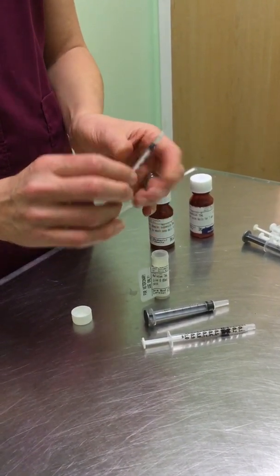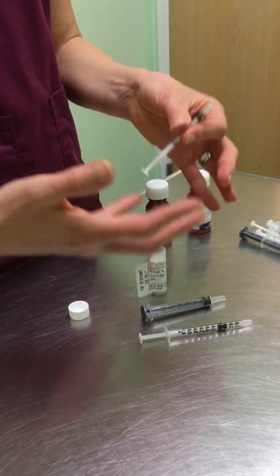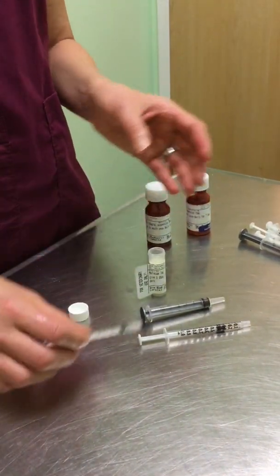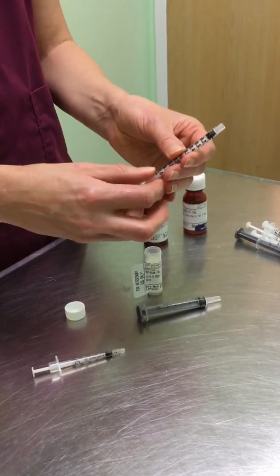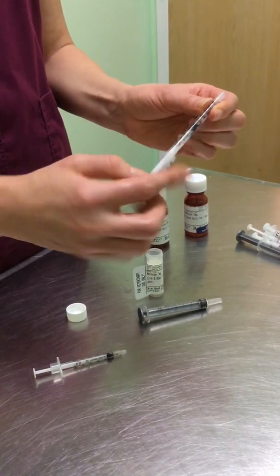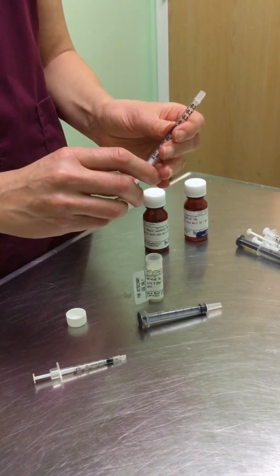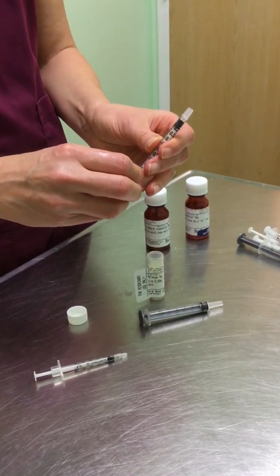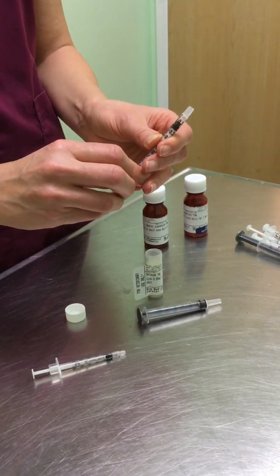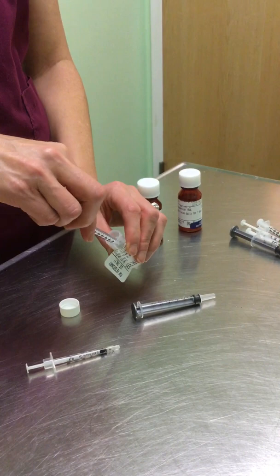Now, if I wanted to use a larger syringe, so suppose I was giving this amount to, like, say, a large parrot that could easily rip or bite the tip of this off, and I wanted to use something more sturdy, I might want to use this syringe. Now, in that case, I want to be clear, 0.05 is not 0.5. That's 10 times more than you need. You want 0.05, so it's less than 0.1. Here's 0.1, which is kind of like 0.10. You want 0.05.